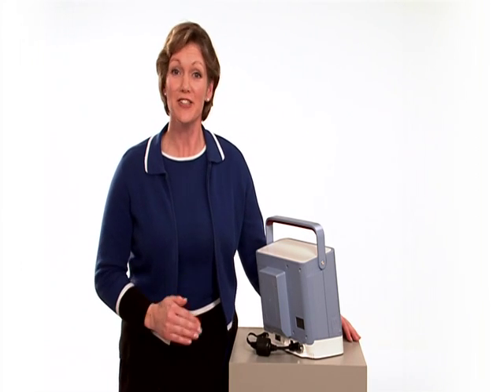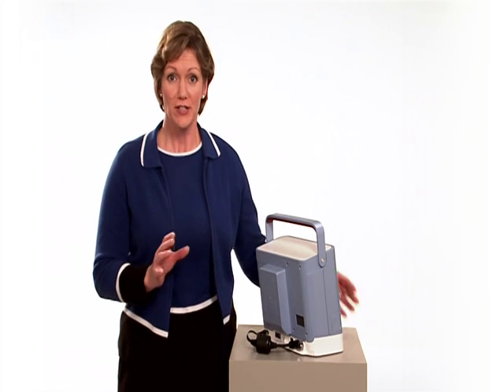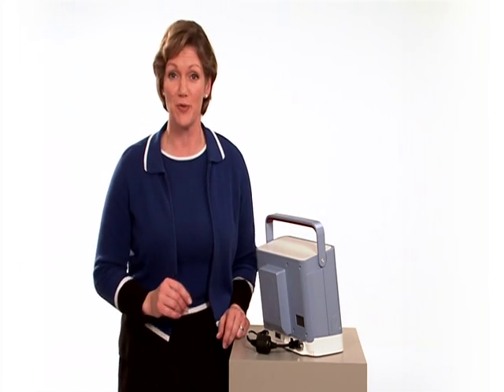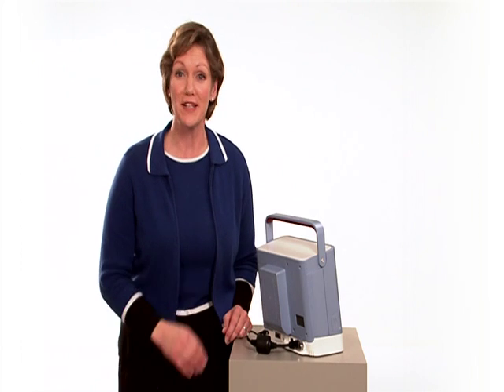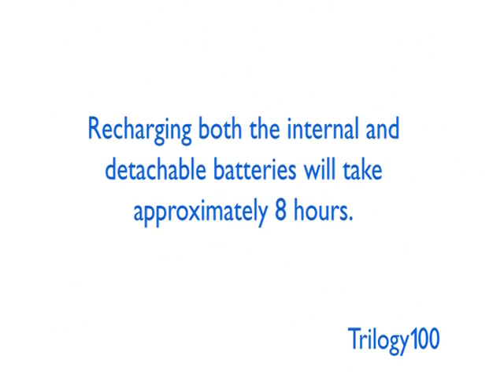Trilogy100 also has an internal battery, which can be used as a backup power source for shorter periods, so the ventilator stays on while you switch between external power sources or transport a patient. Under typical conditions, the internal battery can power Trilogy100 for approximately 3 hours. When Trilogy100 is connected to AC power, it will automatically recharge both the internal battery and the detachable battery pack. A completely discharged internal and detachable battery will take about 8 hours to recharge.